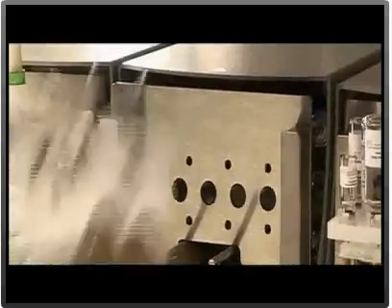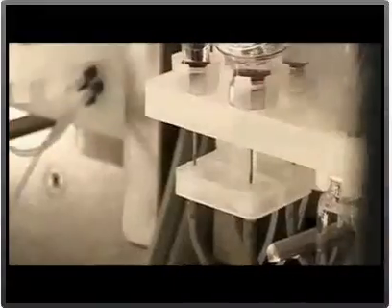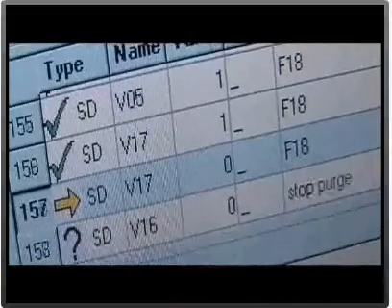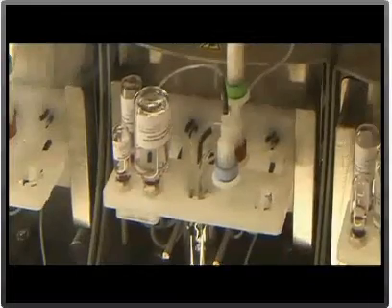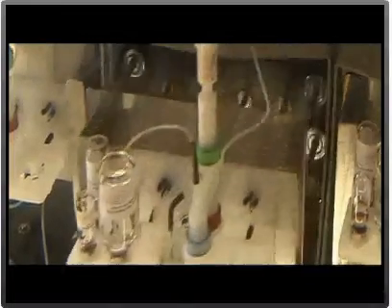The Synthera box is also a multi-tracer synthesis module. By changing the IFP, it is possible to change the radiopharmaceutical to be synthesized. This could enable IBA to produce new compounds easily in its existing facilities.